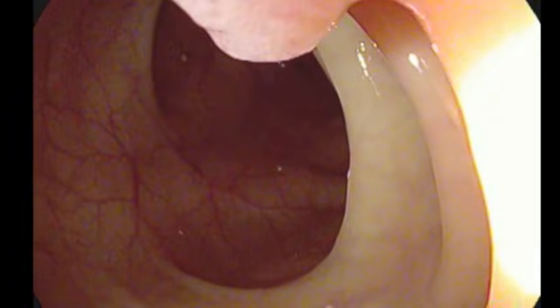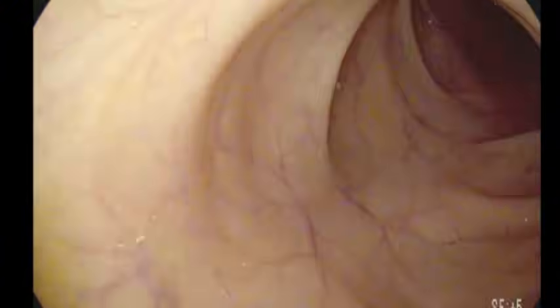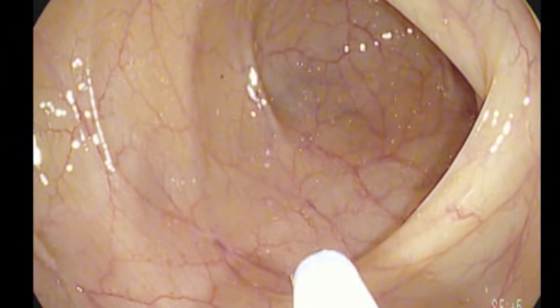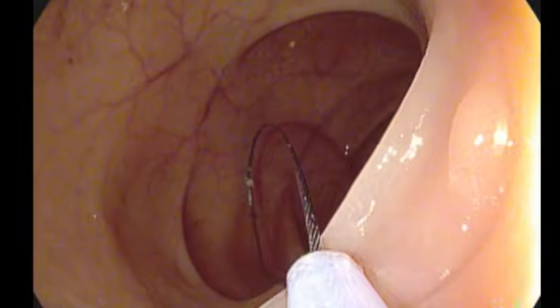On the right side of the screen, a sessile colonic polyp can be seen located in the distal colon. A polyp is any protrusion above a mucosal surface and can be pedunculated, or containing a stalk, sessile, or flat. To remove the polyp, an endoscopic snare is used, which is passed through the endoscope. The snare is then placed around the entire polyp. As the wire is pulled back, the snare tightens, severing the entire polyp from the normal colonic mucosa.